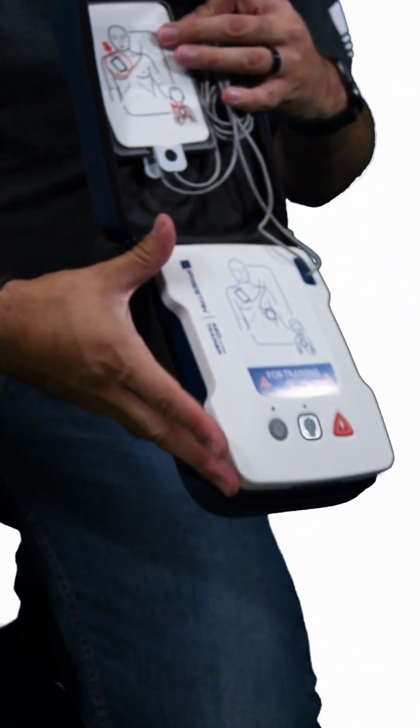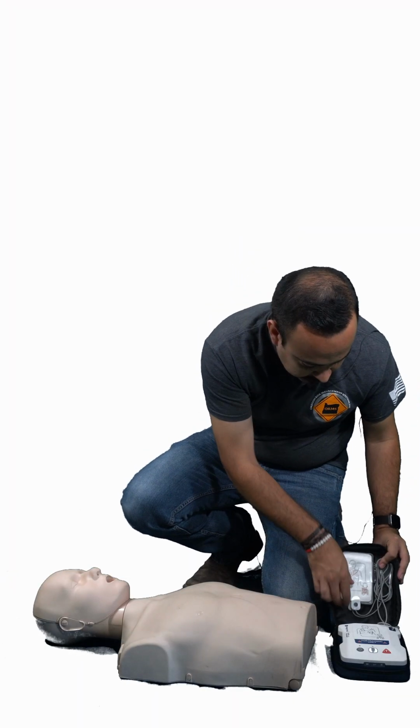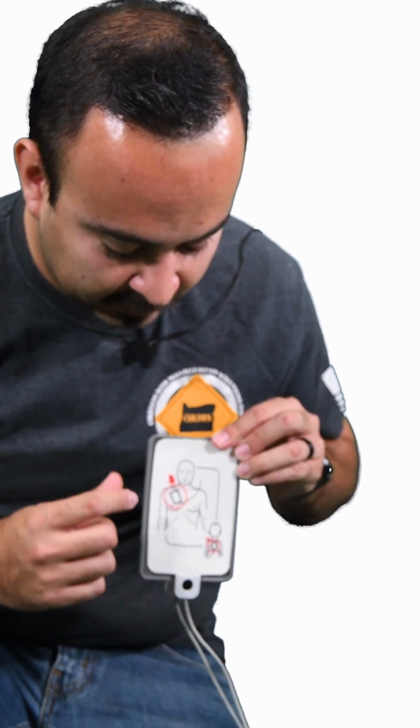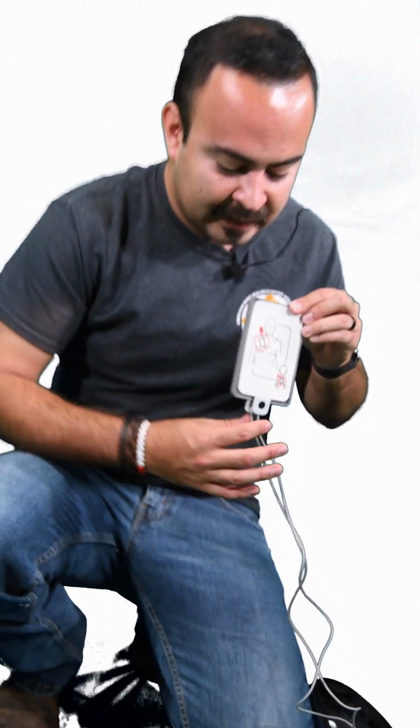So the way to do this is to open up your AED, and you have the unit itself and you have the two pads. Keep in mind that each pad has a designated location. One pad goes on the top right side of the chest. The next pad goes on the lower left side of the chest, just right below the heart.